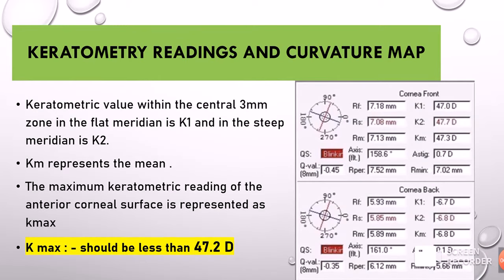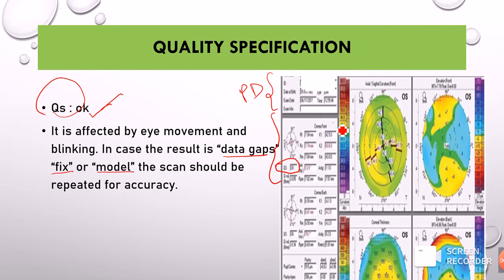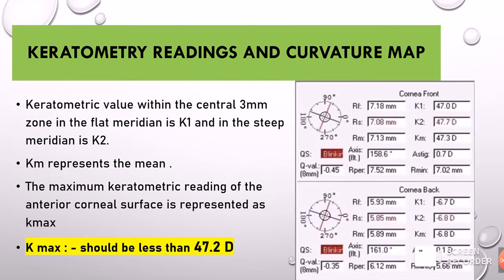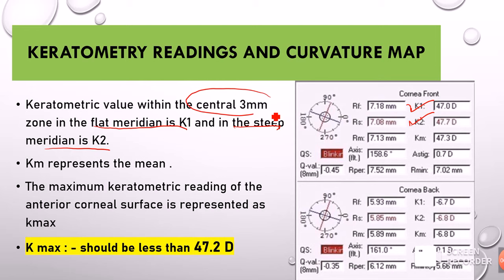The third thing to examine is the keratometry readings and the curvature map. We have K1 and K2. K1 represents the central 3mm zone of the flat meridian, so the keratometric value of the flat meridian is called K1, and the steeper meridian is K2, also representing the central 3mm zone of the cornea. When you take the mean of K1 and K2, what we get is Km — the mean of K1 and K2.